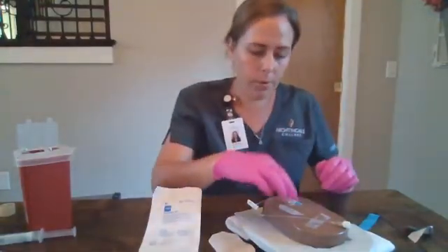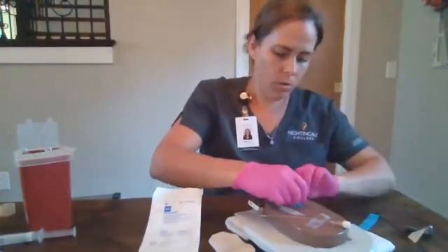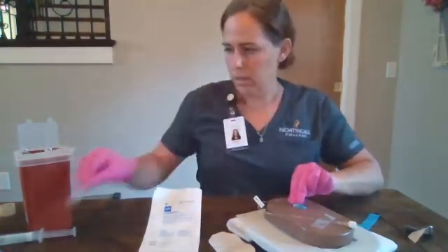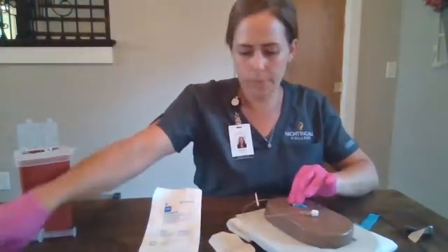We will remove our tegaderm, making sure that we hold our catheter. Discard that. We will discard the tape on the extension tubing.